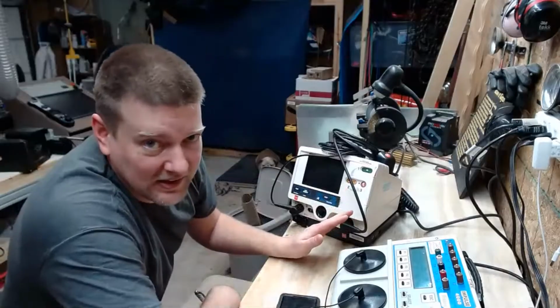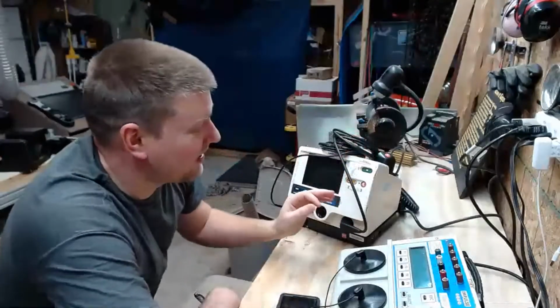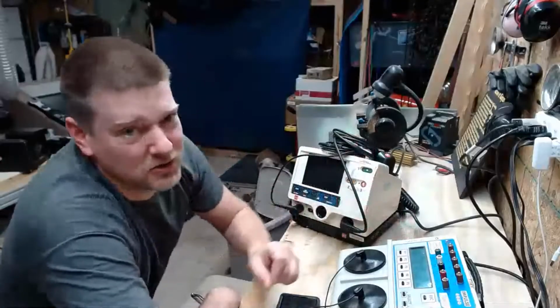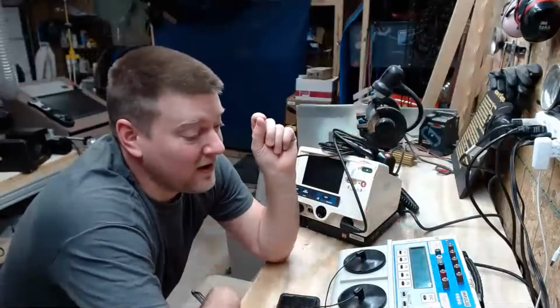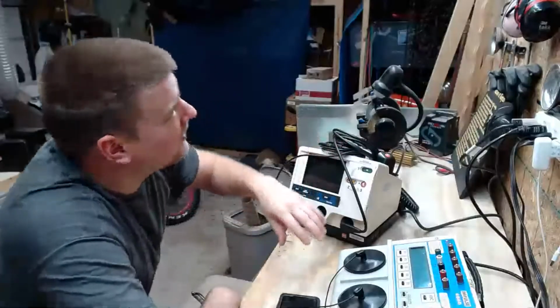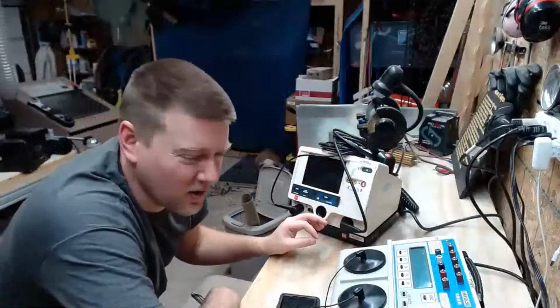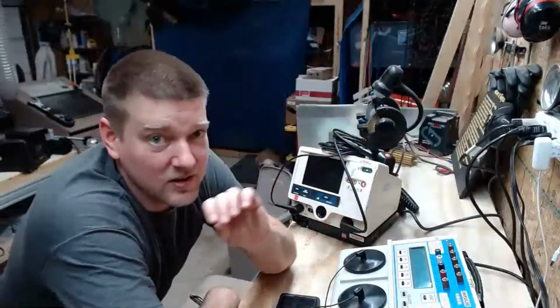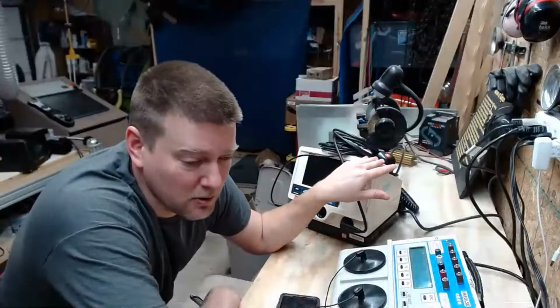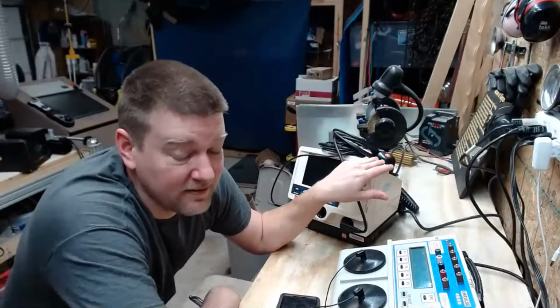Now, me just running through the test like that, do not think that this is a PM, guys. This is not a PM, all right? I'm showing you the functionality and explaining some of the background to that functionality. That's it. These devices are very complex. There's so many tests I didn't do, like the 60 hertz test, the leakage check, and all that, yada yada. Guys, there is a lot of stuff. And to PM one of these, it's going to take you well over an hour. I mean, these guys that can do a defib PM in 5 to 10 minutes.